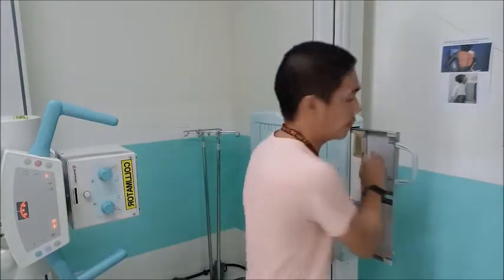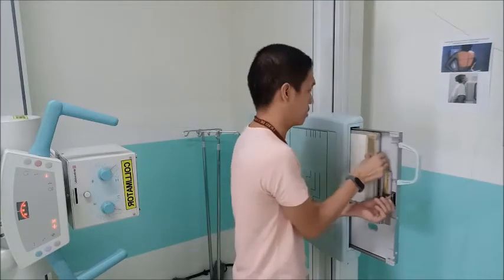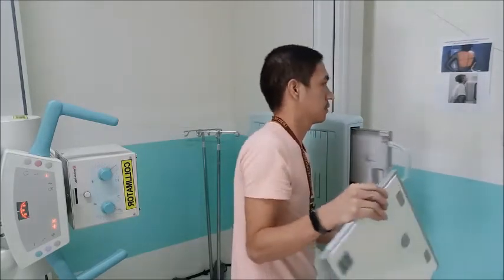Okay, chest examination. Question, what if the patient is pediatric? It depends on the height and the body of the patient. For the basic protocol, for adults it is commonly just chest PA, but for pediatric patients 12 years old and below, we usually do the PA and lateral.